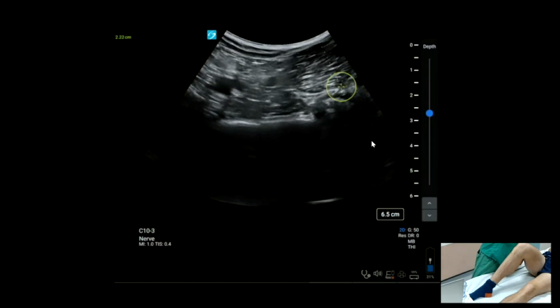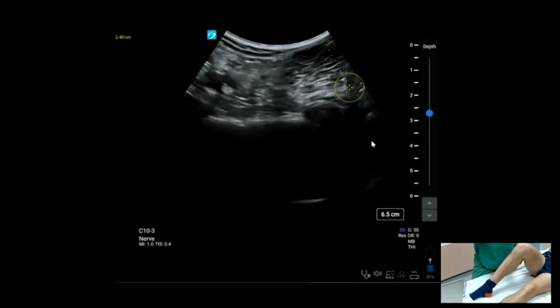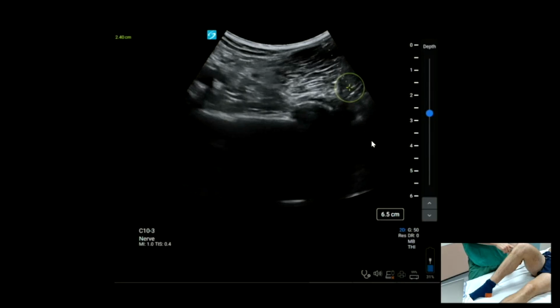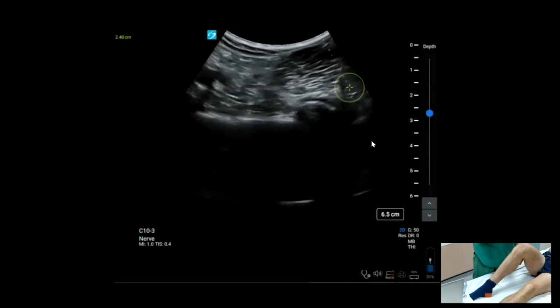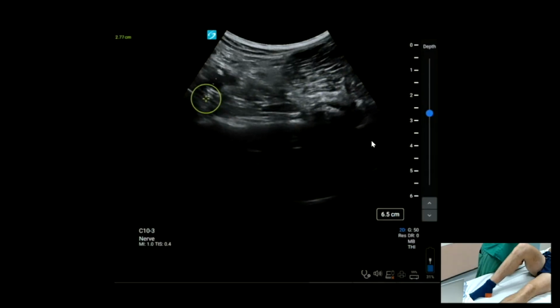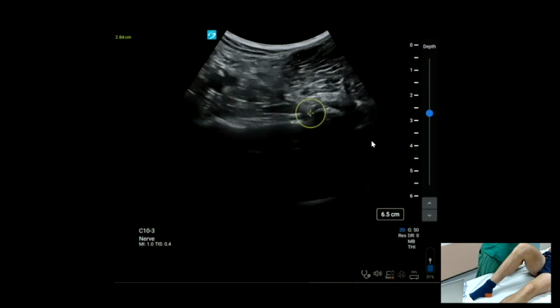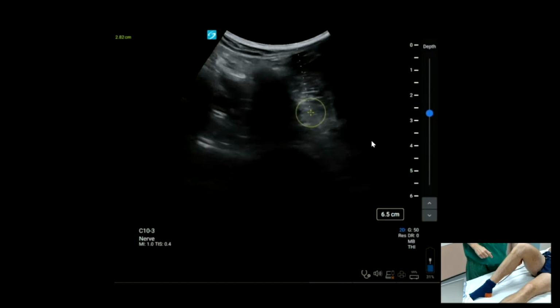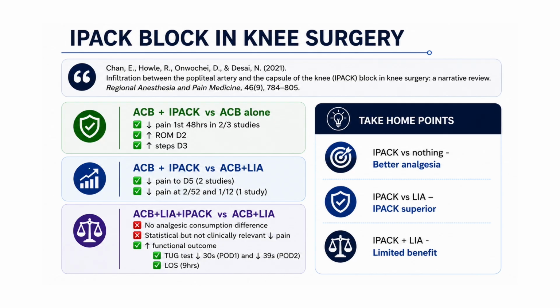I bring my needle in horizontally, so you can look over the side of the screen, see we're about 2.5 centimeters in on Max, which is very, very superficial. I would measure up and insert my needle so that it would have quite a flat trajectory across here. I bring it to the edge of the femur over here, and then I'm infiltrating this space. And I think we've got a video which shows that, when we can talk through as we do it.